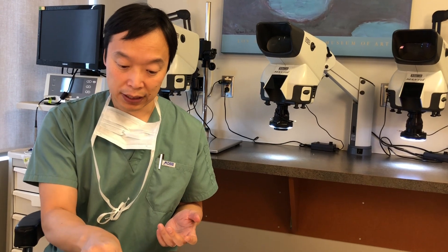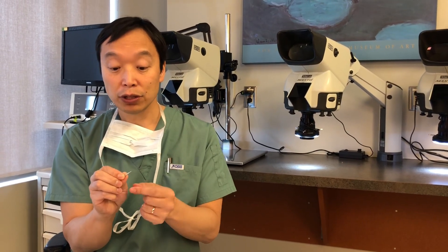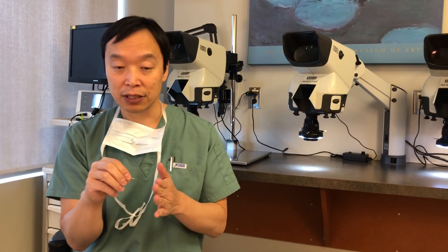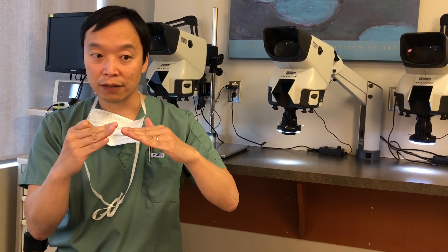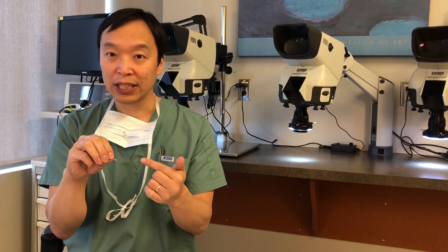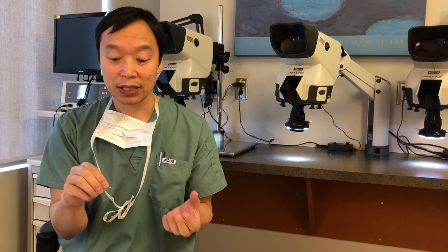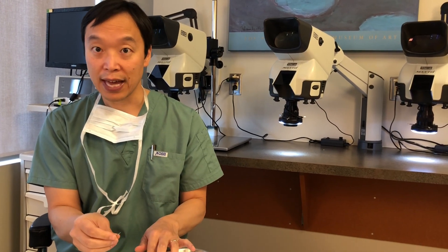Another tip we use nowadays is one of these fluted punches. This is a sharp punch and we also use it with a motorized device to help spin the tip and remove hair follicles. The advantage is that this tip is fluted — not straight-on like the original punch — so the sharp edge flutes outwards, giving it a dull inner side and a sharp outer side. Because of that, we are now able to take out a lot of these hair follicles without transecting them. It's a really nice new technique, and we use it very commonly alongside the dull hex punch.